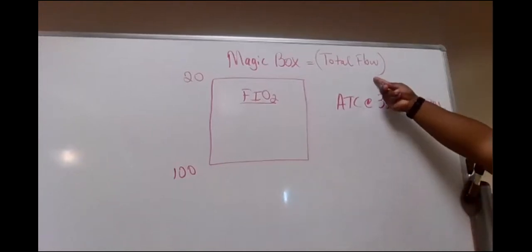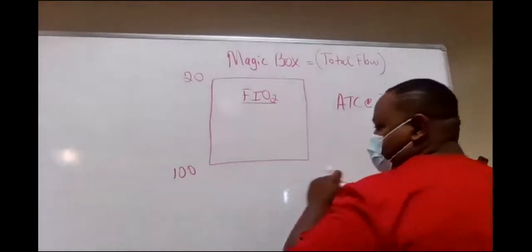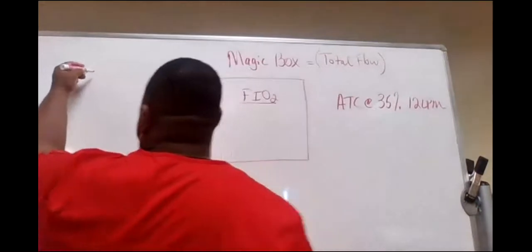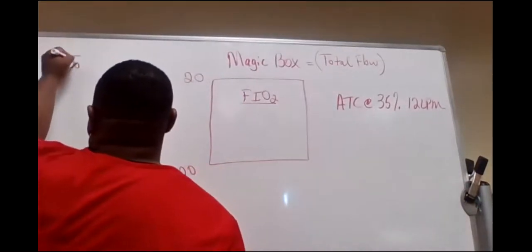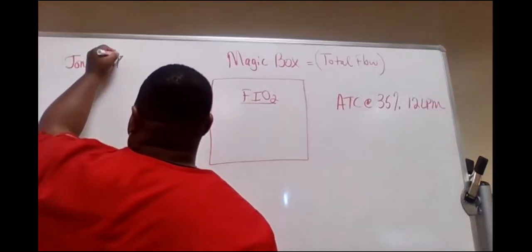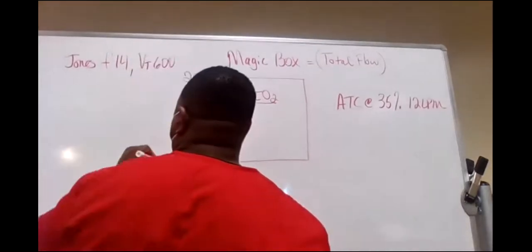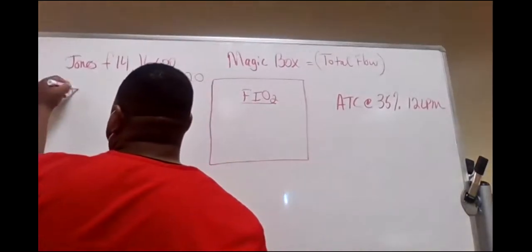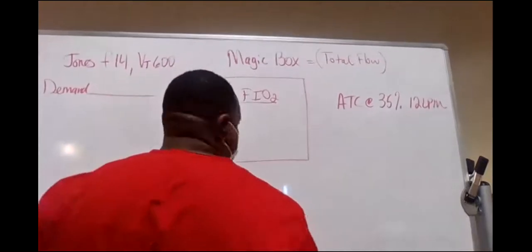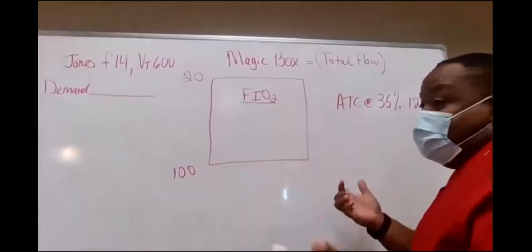What is the total flow of this device? And am I meeting or exceeding his demand? Well, let's find out what his demand is. This is what I have him on, and over here is his demand. This is Mr. Jones. Mr. Jones has a frequency of 14 and a tidal volume of 600. So you need to find out his demand, and then find out the total flow. And look at it. Am I meeting his demand or not?